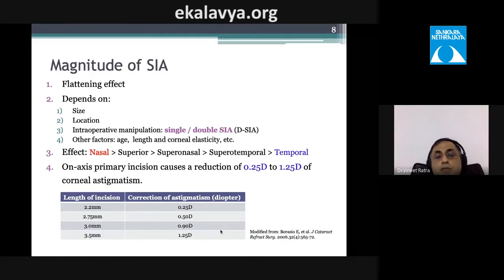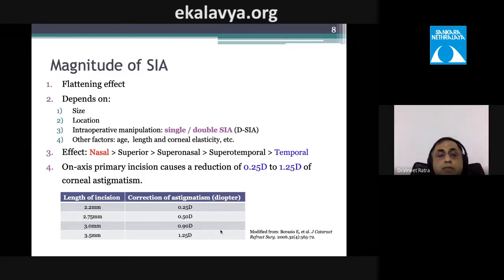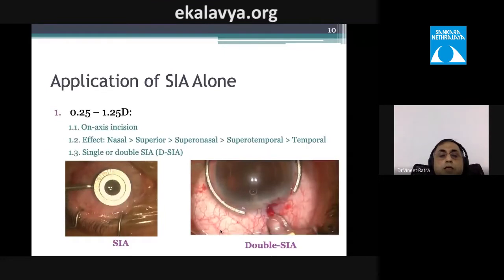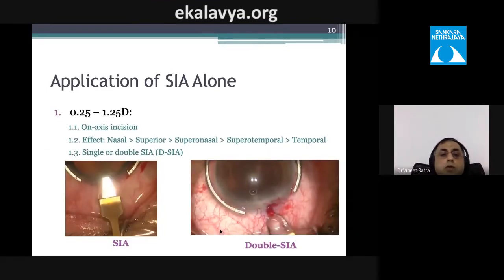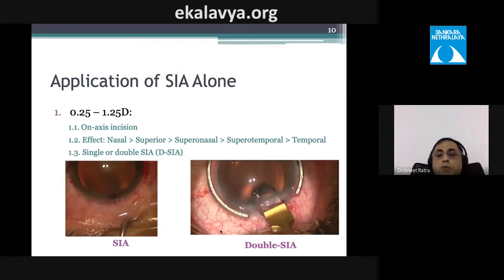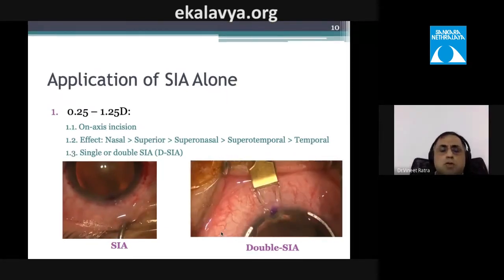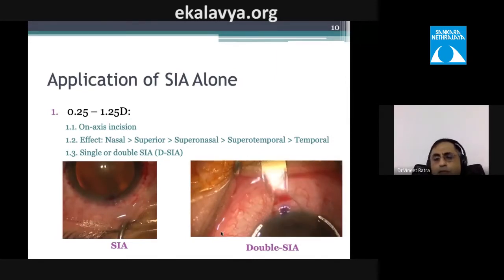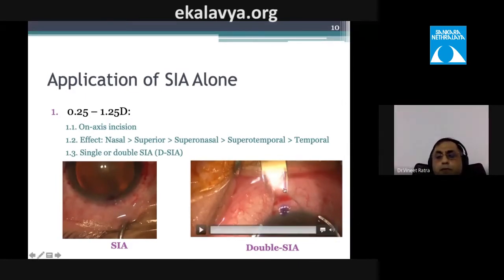An on-axis primary incision can reduce corneal astigmatism by approximately 0.25 to 1.25 diopters, depending on incision length and width. If using SIA alone, a diamond knife is preferred, though metal knives are also acceptable. A video from Shenzhen demonstrates a double SIA technique.